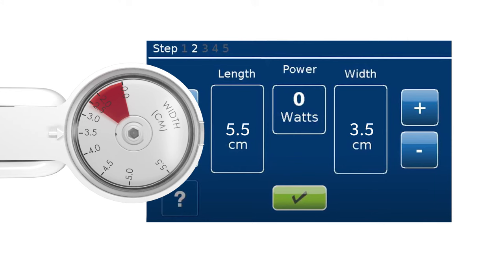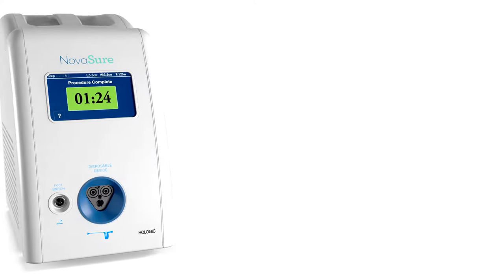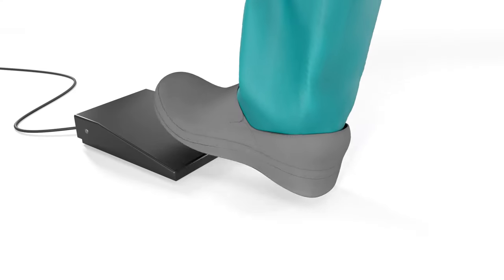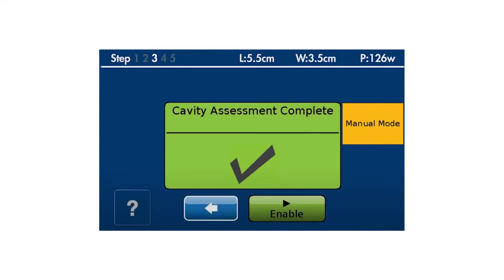Confirm length and width measurements are correct by pressing the green check mark. Do not treat a patient with a uterine cavity width less than 2.5 centimeters as determined by the width dial after device deployment. Slide the cervical collar forward using firm pressure on the thumb tab until the cervical collar forms a seal against the external cervical os. Begin the cavity integrity assessment by stepping on the foot pedal. Once the cavity integrity assessment is passed, a green check mark appears. Press the Enable button on the RFC-10 generator.